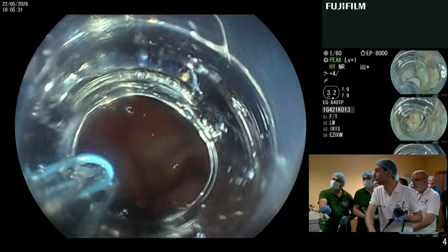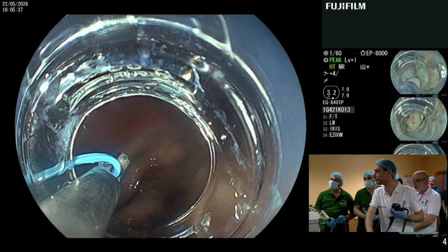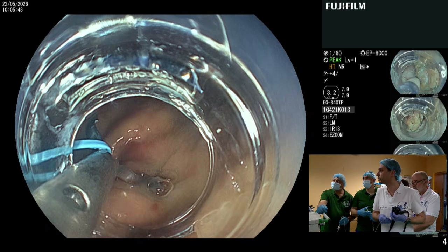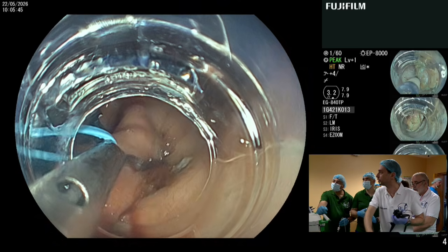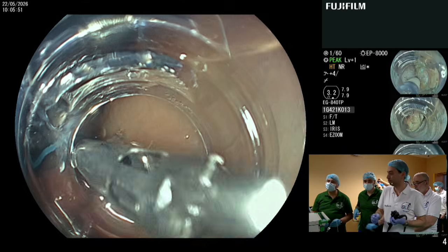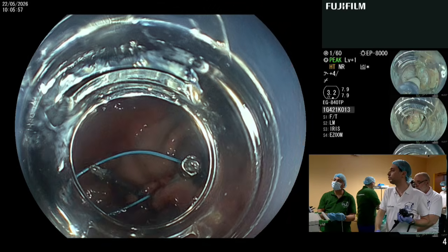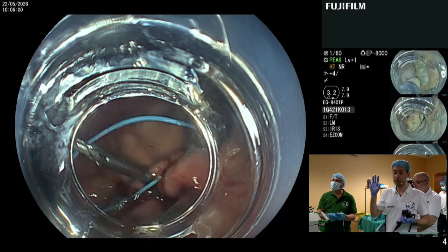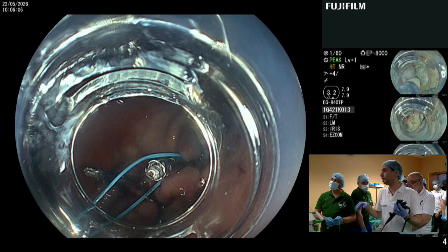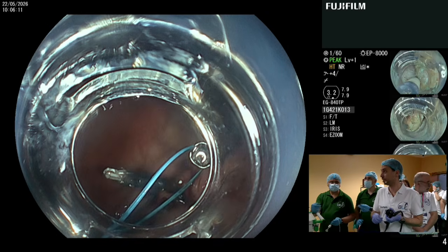So we will approach the area of the defect. Here it's almost closed. I will place the first clip behind the lesion over here. Please open the clip. Here. All right. Fire. Go. Perfect. Now, you will open the loop and you will give me more clips. Now we will need 6, 7 clips. The concept is to attach the loop around our defect, and then we will close the loop, and we will seal the defect in a very safe way.